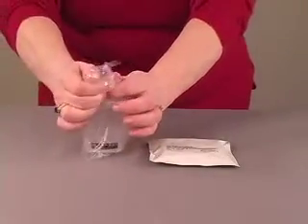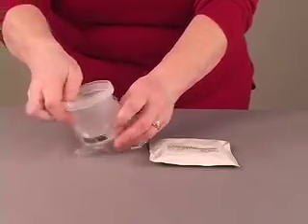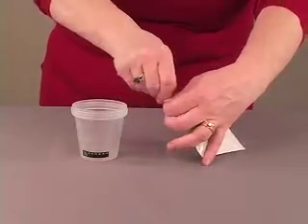Waive test procedure. Remove the cup from the clear pouch. Remove the lid containing the test strips from the foil pouch.